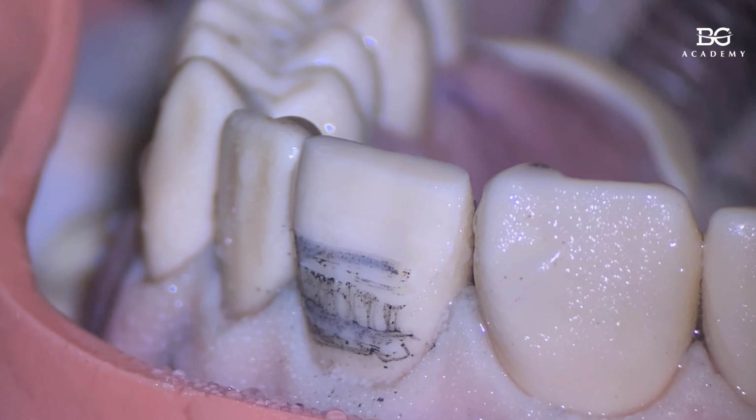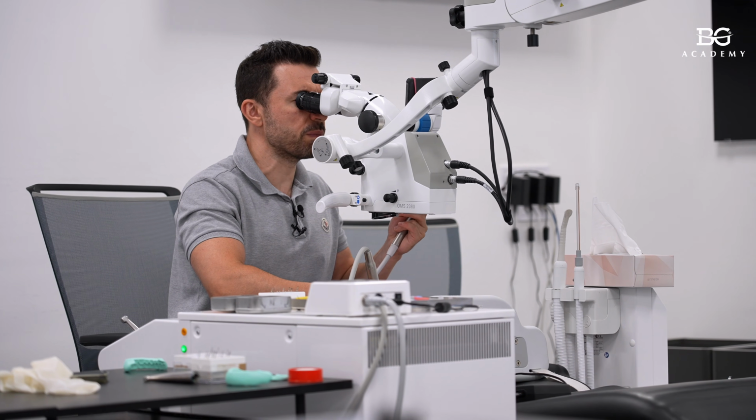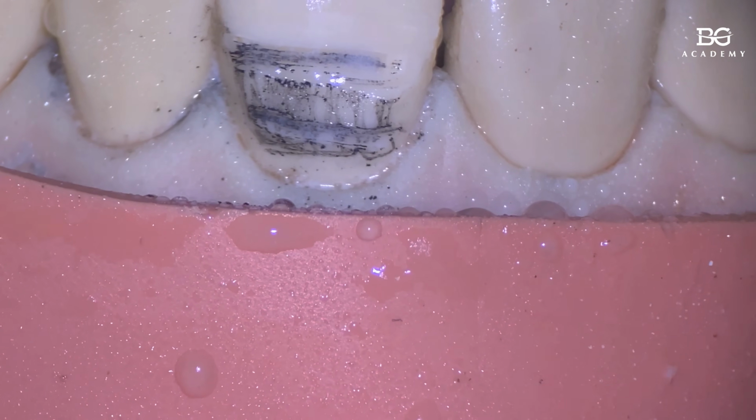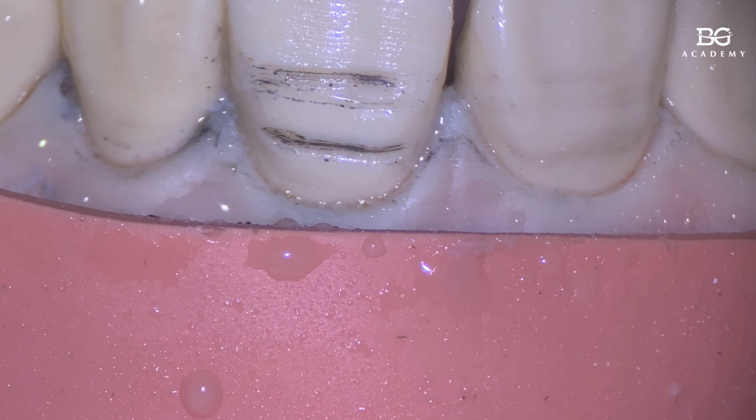Done. Once you see no groove, no line, that means enough. Don't continue, because if you continue, I will have a question, what are you doing. And there is an answer, you are over-prepping. Okay, so once there is no line, that's it, we're finished. Then I'm going to prep the other side, and then we are going to prep the middle plane.